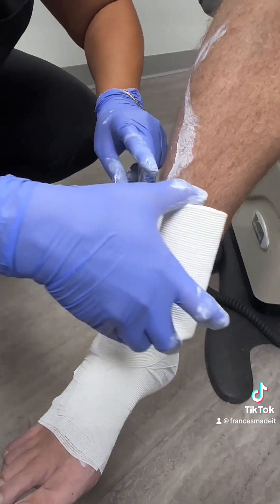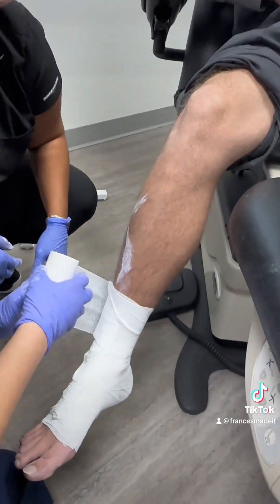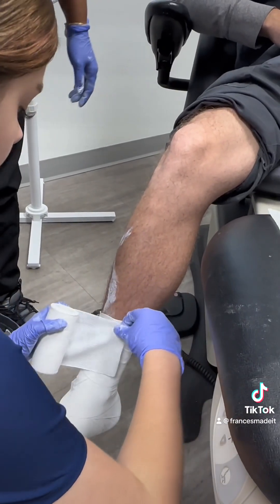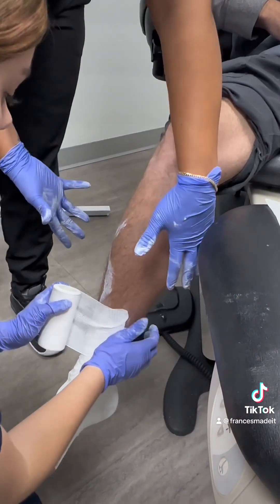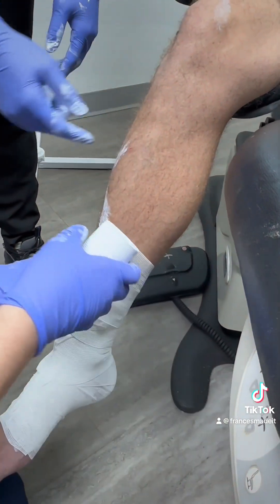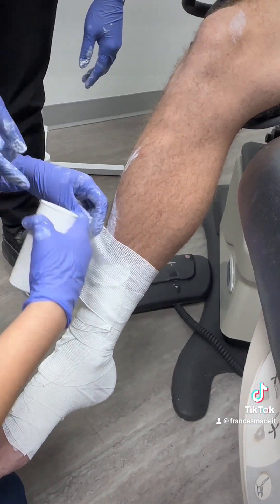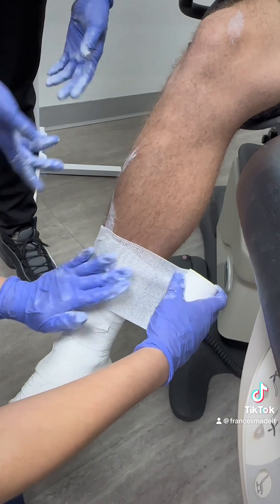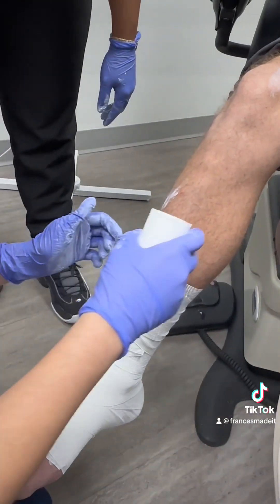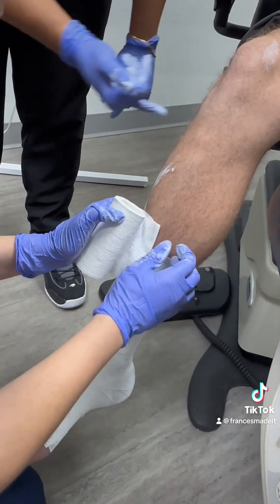50% coverage, and you work it all the way up. If you have a very large leg and you need to use another roll, wherever you finish off is where you start again. If you have enough left, you can either cut it and finish it off there, or continue using it. I always like to do this with the patient's leg hanging because it lets you know where the bending is.